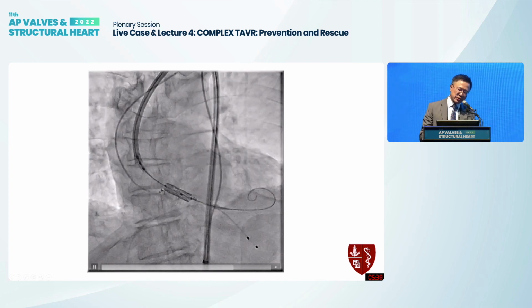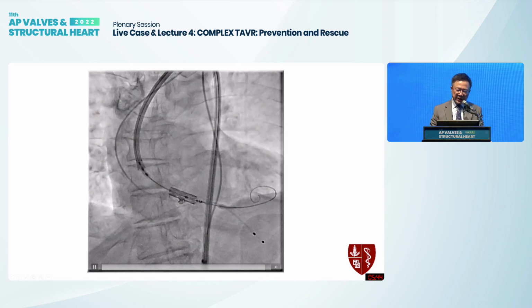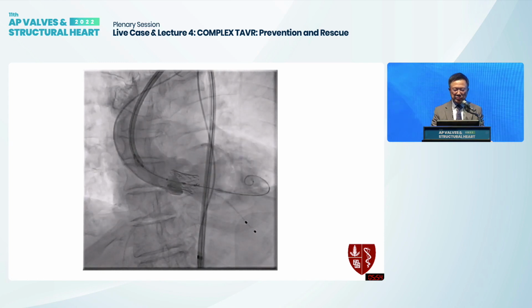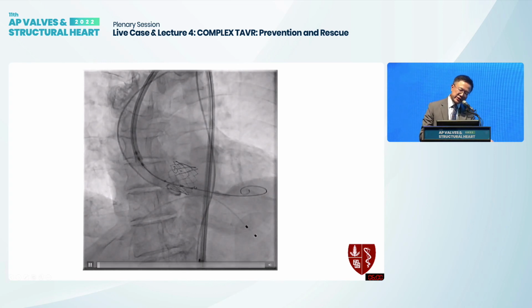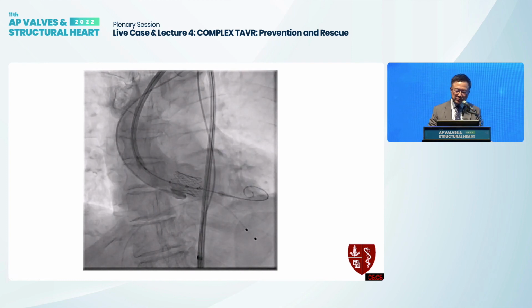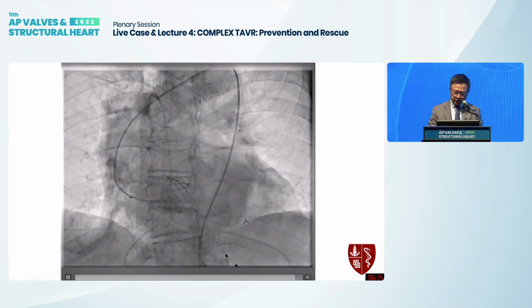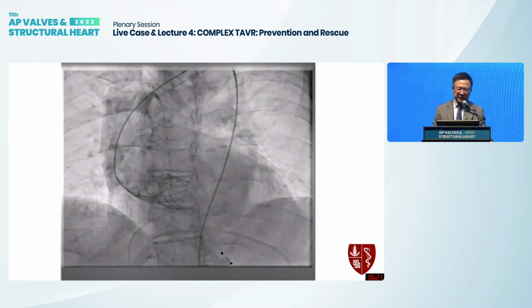So now you know that the commissure in the back of this valve, in the three-cusp view, would go towards the left and non. So I think we can go to the next one. This is just the inflation, pretty standard. The little shots, and you can see actually in here, for those of you who have used S3, there's three little markers, which are basically the three commissures that are now labeled, compared to before, when they were not seen well. So this is the final picture. Essentially, the position is quite good, and you can see the three little tabs at the commissures, and you can actually get better views of that. And this study has a CT subcomponent to really look at how good this system is in aligning the valve to the commissure.